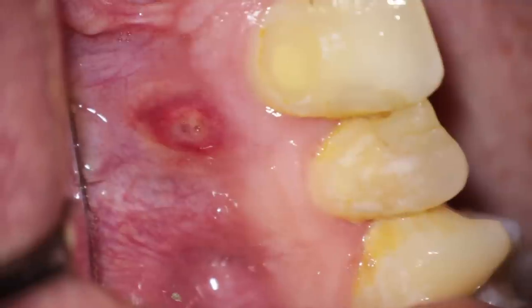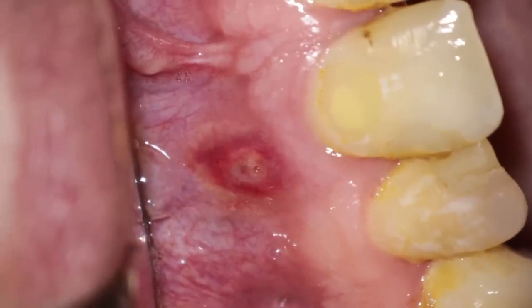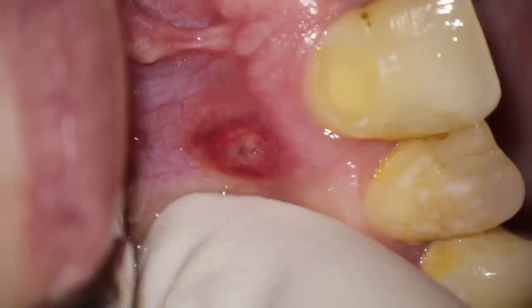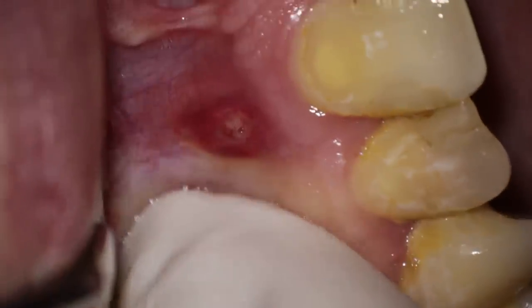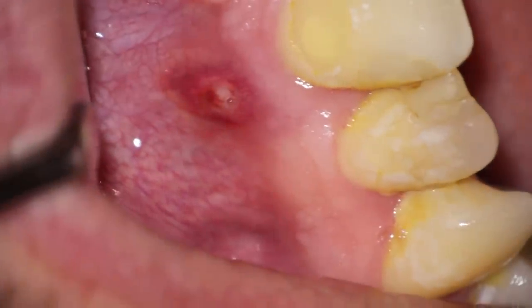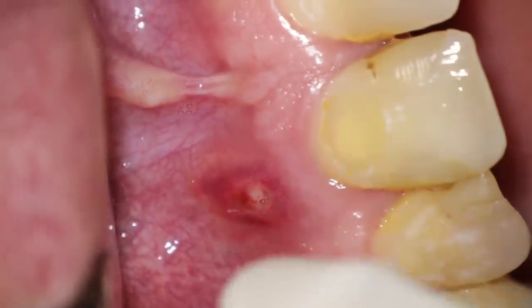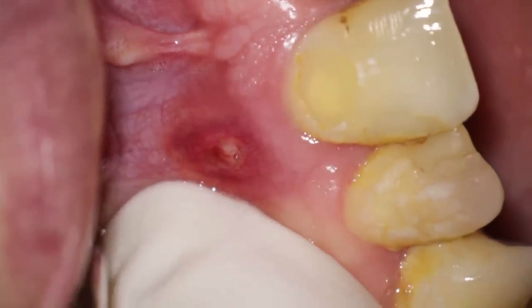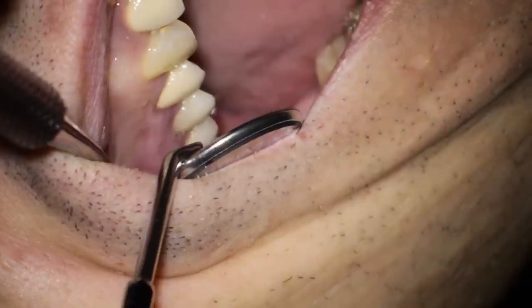You can see a sinus tract on the maxillary central incisor. You can palpate the swelling and in most cases express some fluid. You can easily make your diagnosis by introducing a gutta-percha cone into the sinus tract to trace where the inflammation comes from. In this case, it was a vertical root fracture of this central incisor.